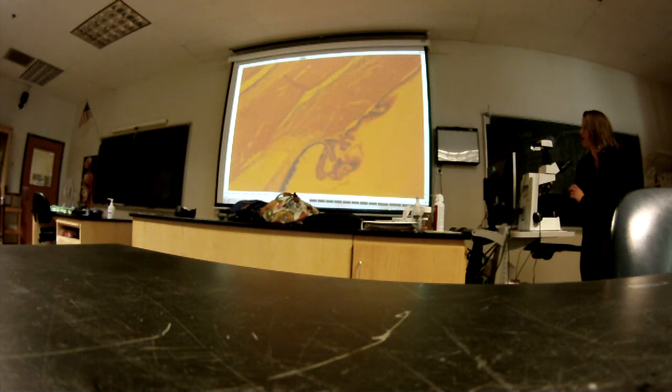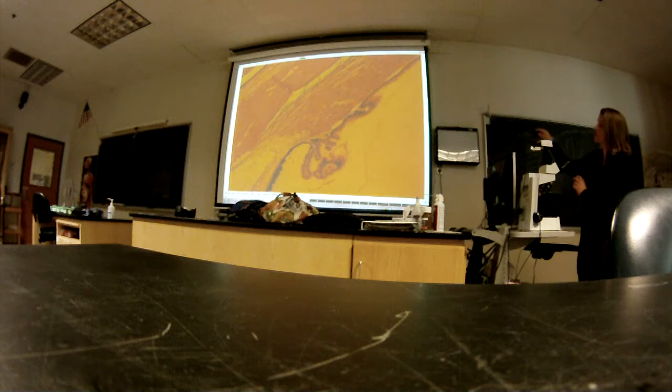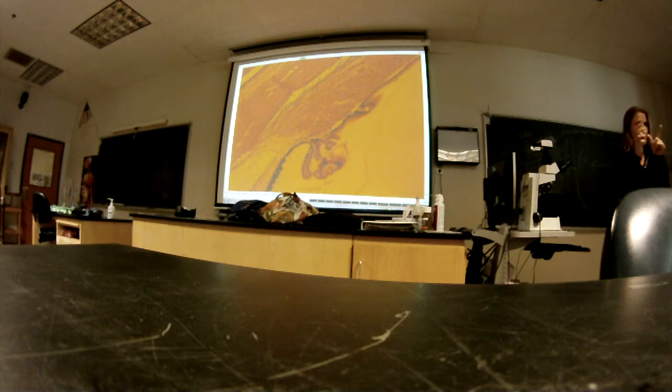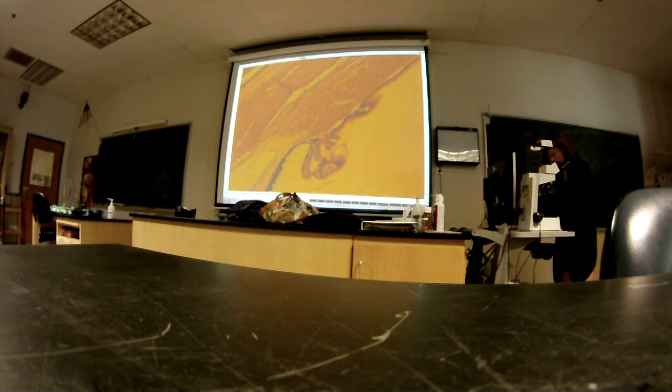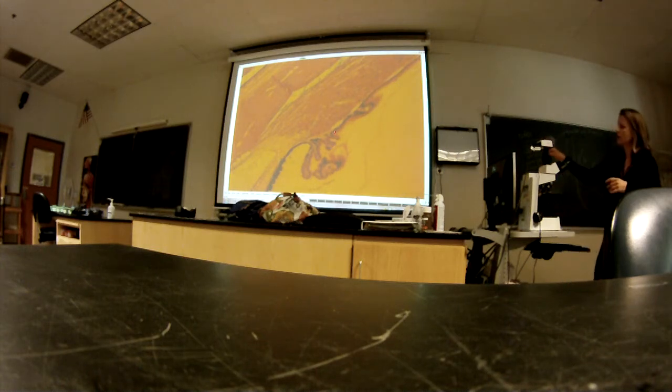Okay, and here the smooth muscle starts to come in. That's part of the ciliary body, and you follow it up. So then this is the ciliary body. If you follow the choroid, it changes to smooth muscle and it kind of thickens. This is called the ciliary body. These little processes are also part of that, but were those on your list? Yeah, both were on. The ciliary processes were on there. This is really good. We didn't see ciliary muscle. Yeah, so this entire structure is the ciliary body.